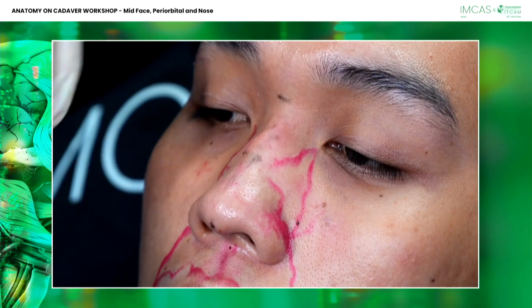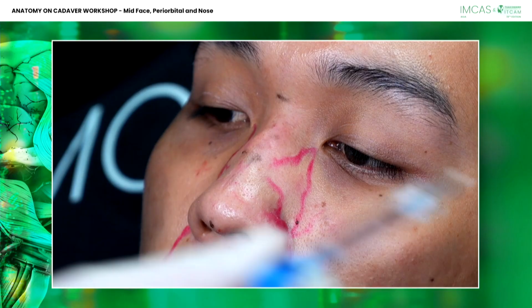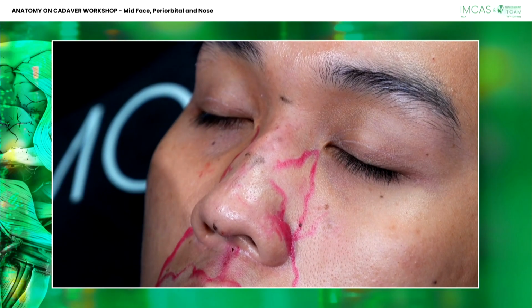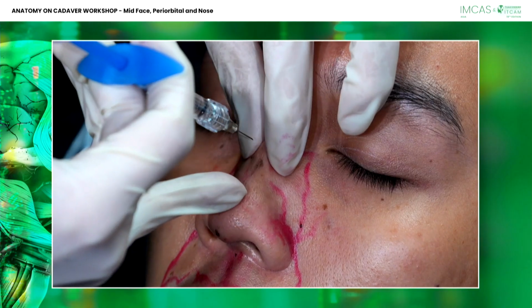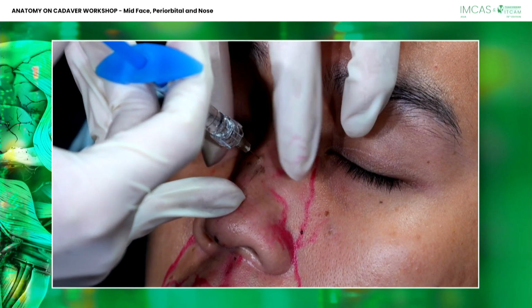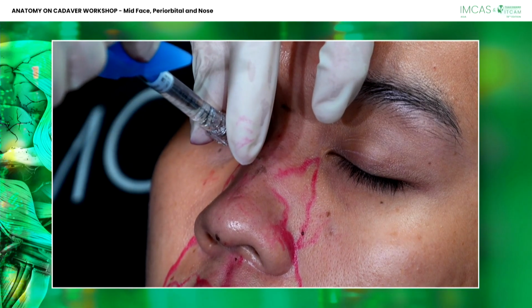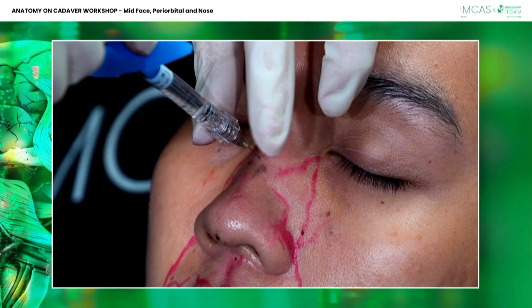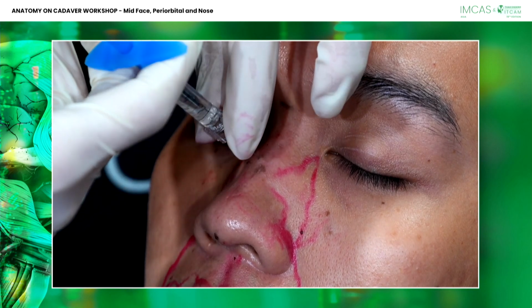Okay, the second point here, below it, and again, need to be careful. So here is the second point, deep down to the bone again, and slowly aspirate here. So I will count in my mind around 10 seconds.